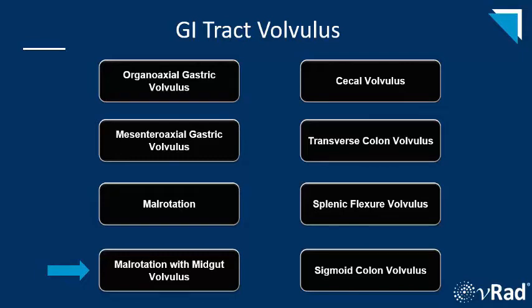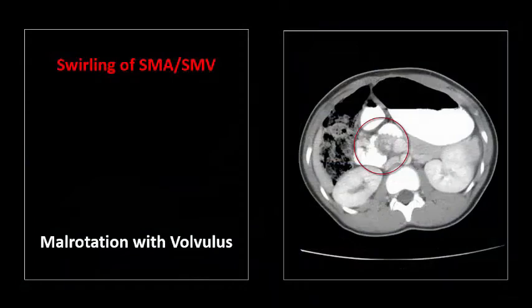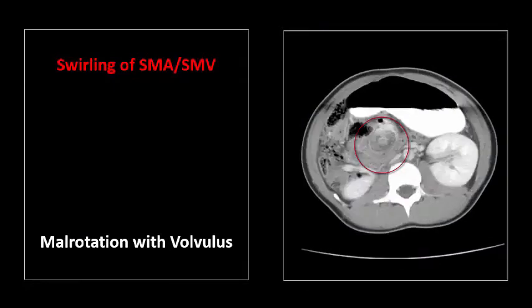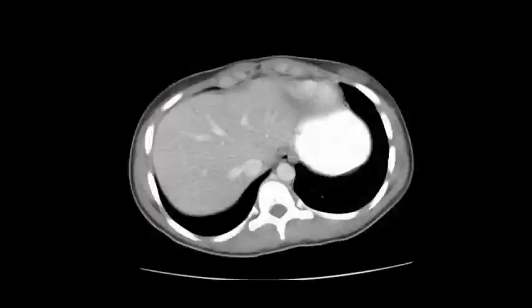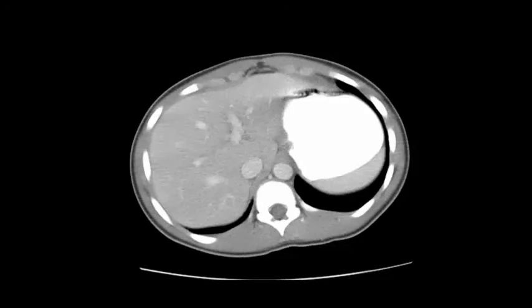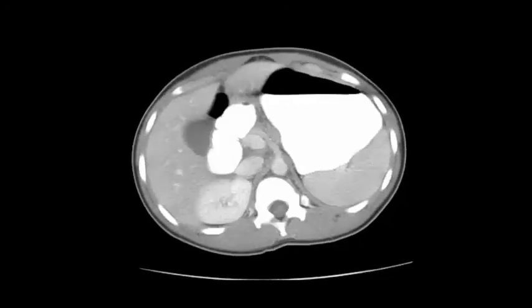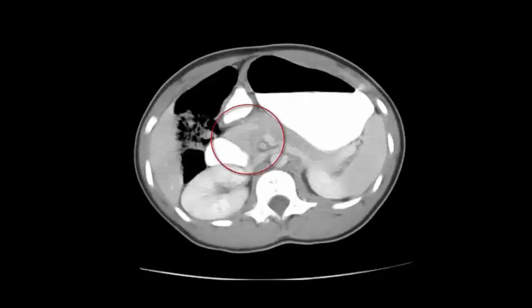The next case is a congenital malrotation complicated by midgut volvulus. Note the swirling of the SMA and SMV around each other, and also the swirling of the duodenum and jejunum around each other in the right upper quadrant. Here's a short cine loop focusing on the right upper quadrant where we see the duodenum and jejunum twisting around each other, compatible with malrotation complicated by midgut volvulus.